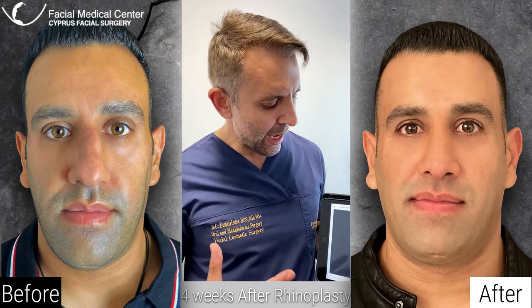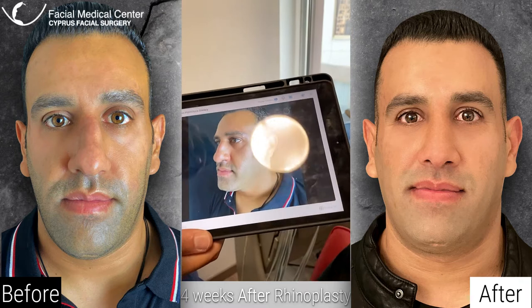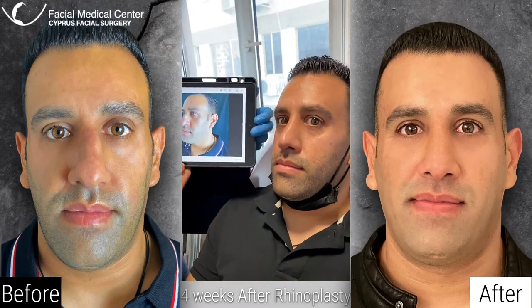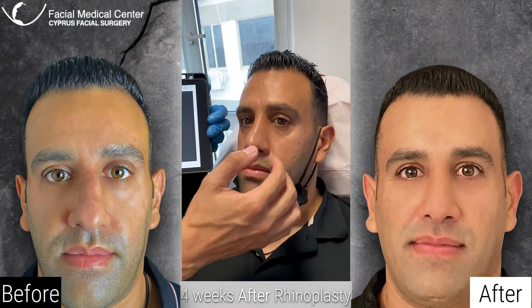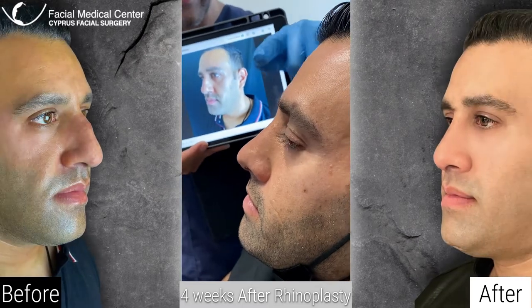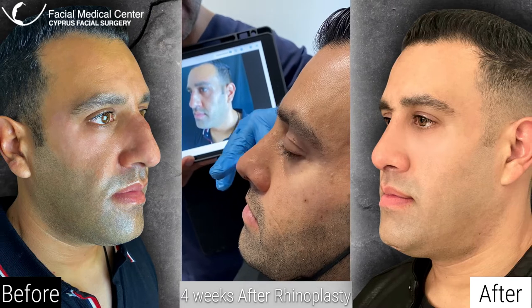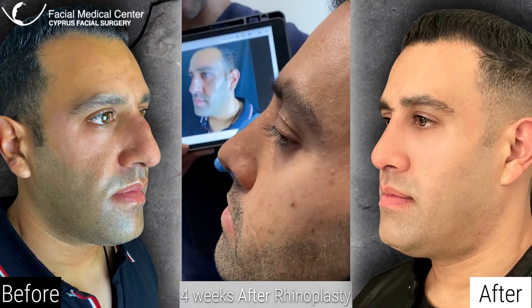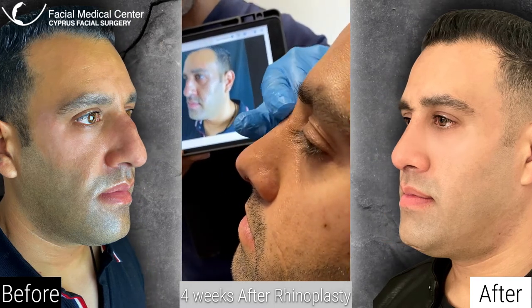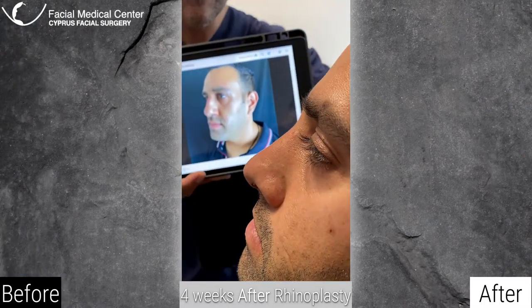I'm going to show here a patient just 3.5 weeks after rhinoplasty. Let's go back to the patient and I'm going to put them next to each other. And you can see the nose now, you can take it from the side. You can see that the hump is being reduced, as you can see here. The tip is being minimized. The tip definition points are very well defined. There is upward rotation of the tip, and of course a very nice dorsal surface with a very nice form of the aesthetic lines.